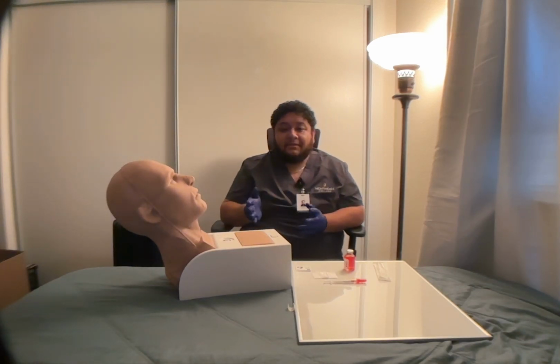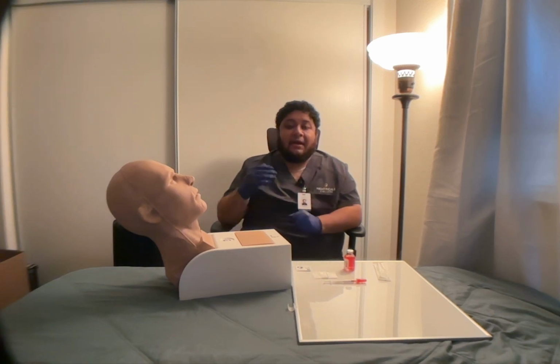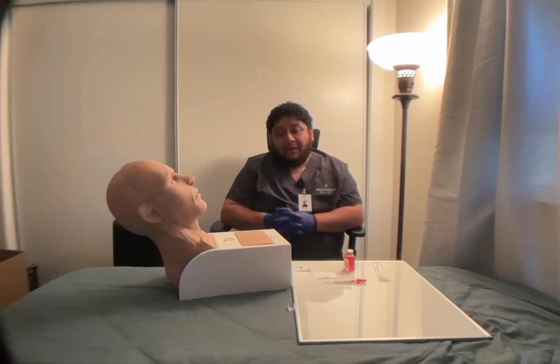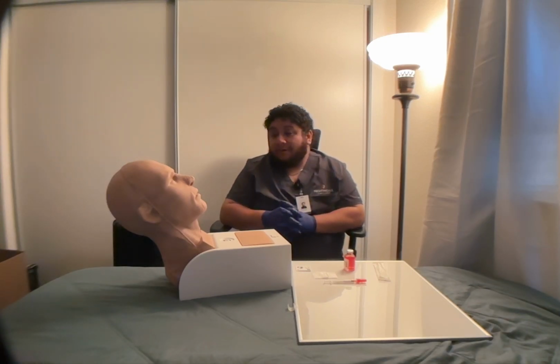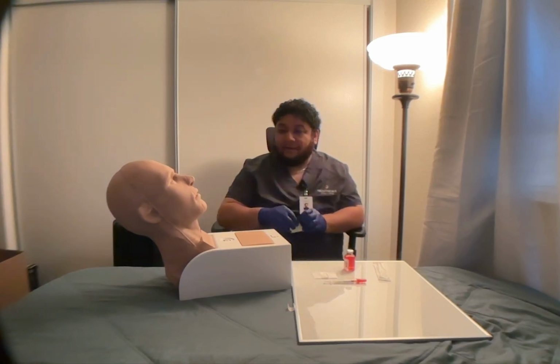Now, if one forearm is not available, I can go and check the other one. If both are not available, I'm going to go ahead and use the upper back. Okay. Now, Mr. John, thank you for letting me assess your arm. Okay. Now I'm gonna go ahead and clean your arm with an alcohol swab.